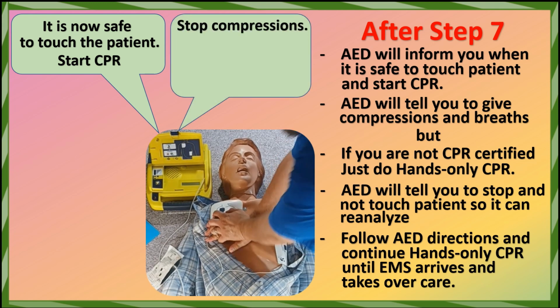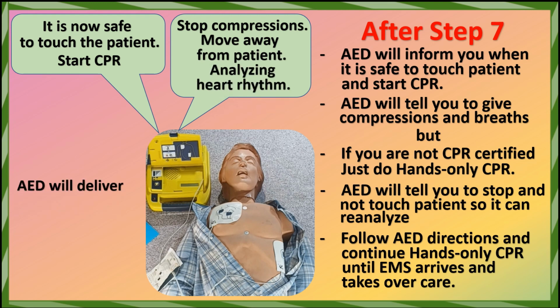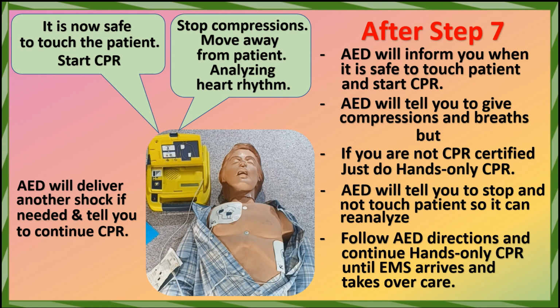Stop compressions. Move away from the patient. Analyzing heart rhythm. The AED will deliver another shock if needed and tell you to continue CPR.